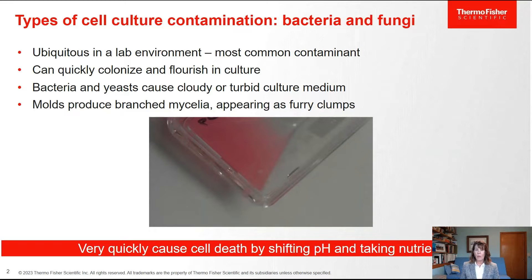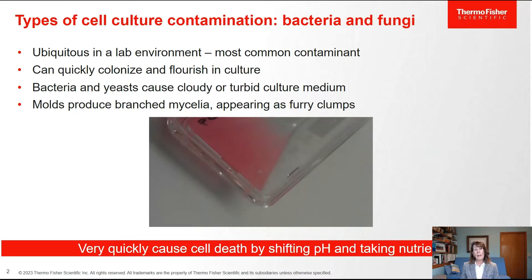When you get a cell culture contamination with bacteria and yeast, they cause your growth medium to become cloudy or turbid, so you know pretty much as soon as you pick up that culture dish that you've got a contamination. If you have a contamination with molds, you can see them floating around — they look like furry clumps, kind of like little tumbleweeds. Bacteria and fungi make your culture really acidic, take up all the nutrients, leaving nothing left for your cultured cells.